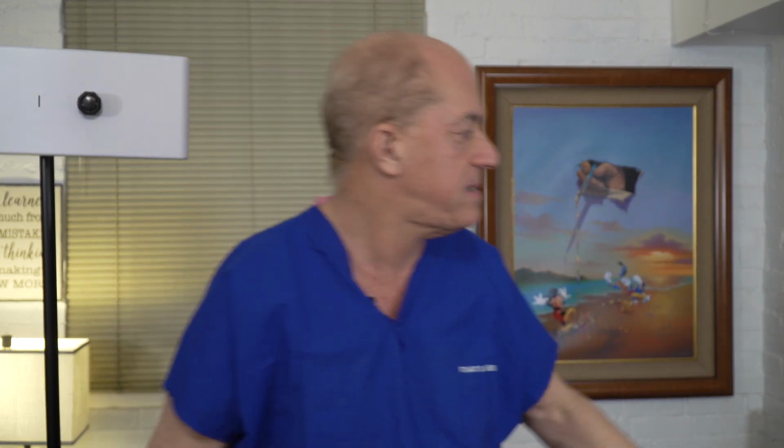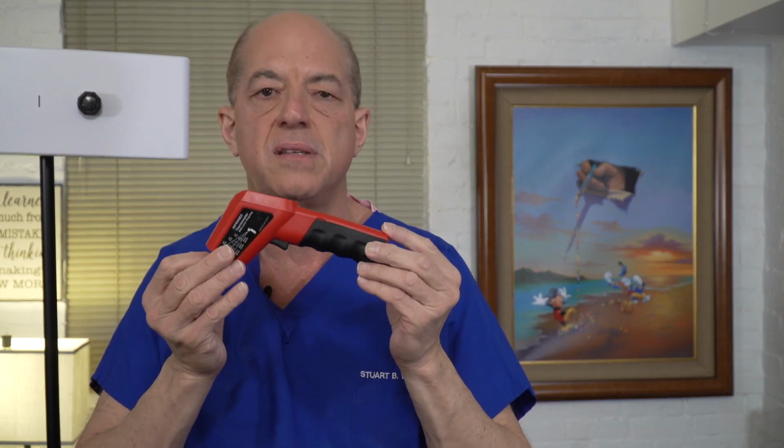You have to actually point the thing at each individual person. So the difference between the passive one, which can see many people walking by, and the active version is that with the active version, you have to point it at somebody's forehead from about 3 inches away. So that's the two types of scanning systems. Again, because 80% of the people have a fever when they have active COVID-19 disease, this is not a bad idea to have this as one of the ways to recover after COVID-19.